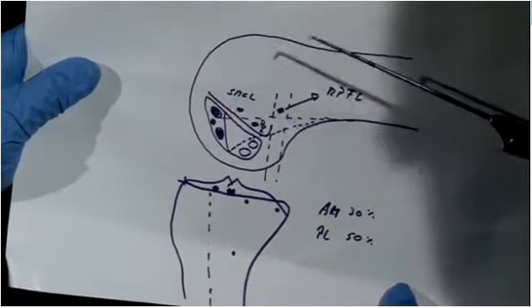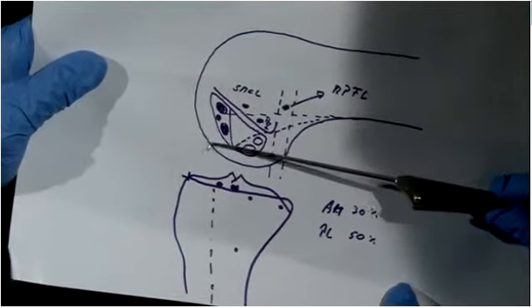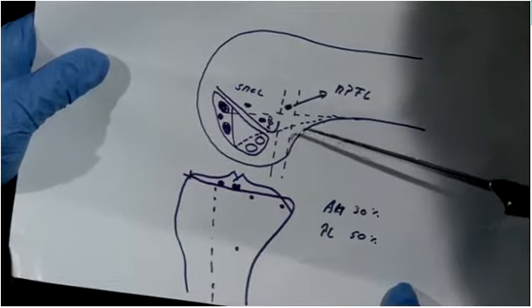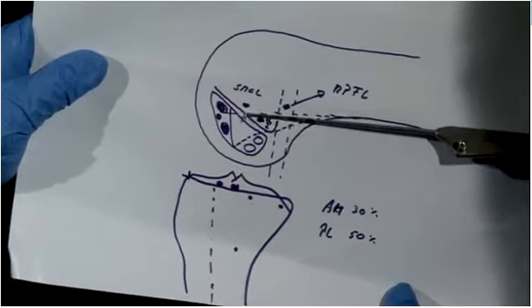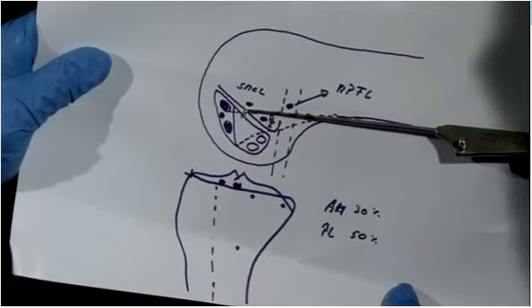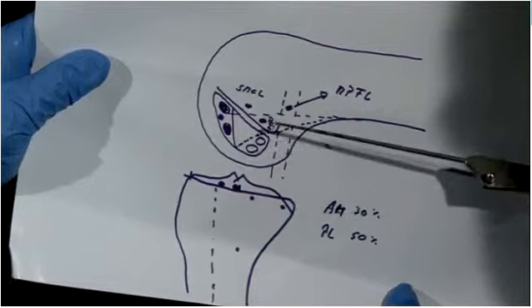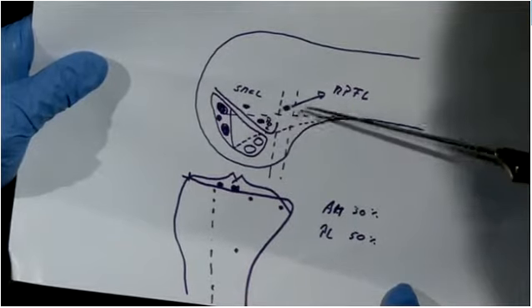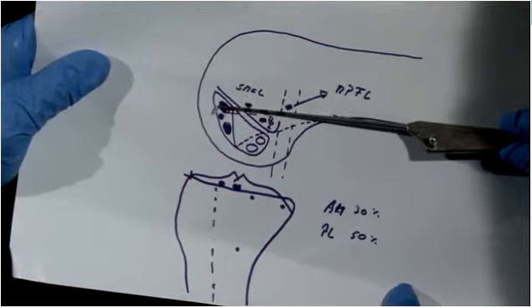I think the first thing when you use fluoroscopy is to have a perfect superposition of the condyles. That's one major thing you need. The second thing, which is to me the most important, is the posterior cortex of the femur. And once you have this, you can really draw all these different points here. I'll go through them one by one. So you have this parallel line to the posterior cortex, as I said.